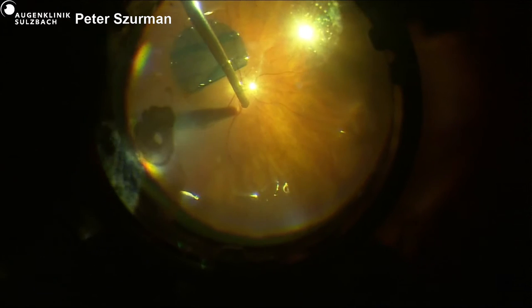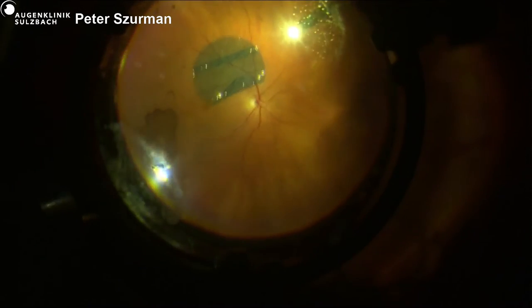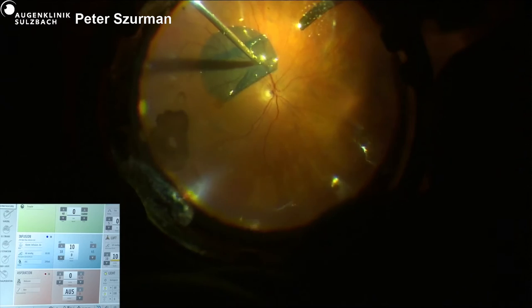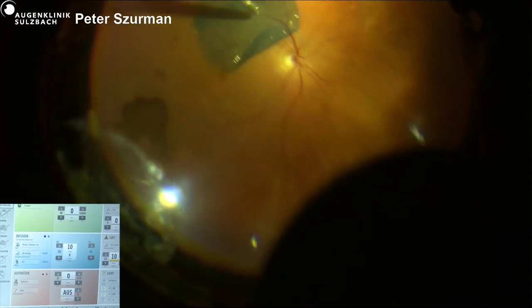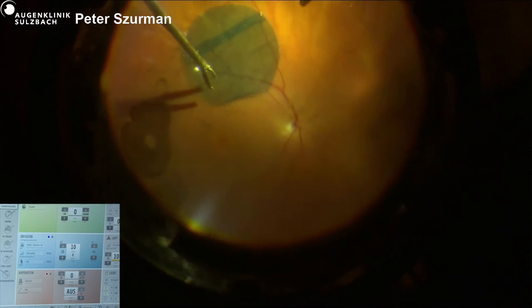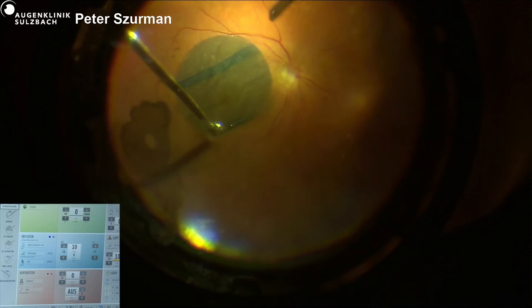So you're still on air? So now you are going for a really dry eye here at this point. Yeah, very good question, because we are not going for 100% dry eye. We need a small fluid layer to expand the patch. But it's perfectly, not perfectly, but it's well expanded. Interesting. You need just enough fluid to be able to skate it across the retinal surface, but not so much that it folds and becomes uncontrollable. Exactly, yeah. Skating is a nice word.